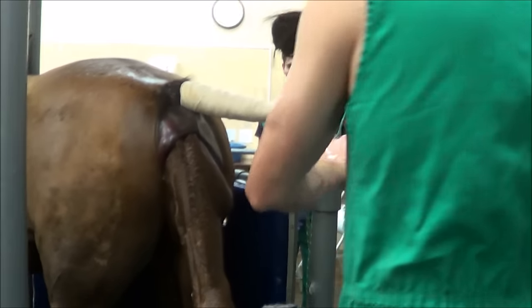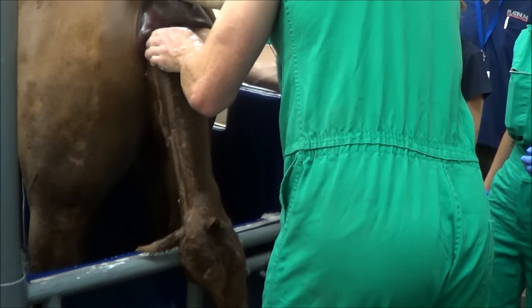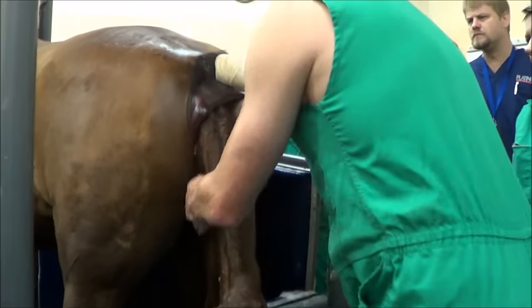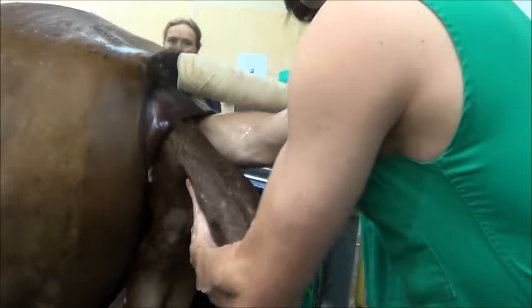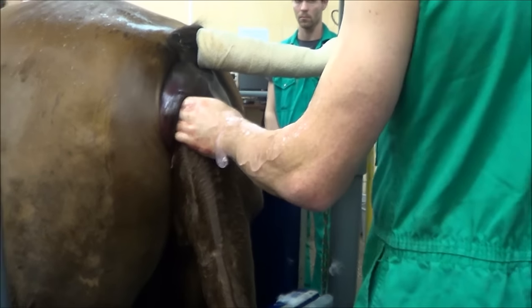Here you can see a very nervous mare restrained in a crush. The problem is fairly obvious. I've thoroughly scrubbed my hands and forearms up to the shoulders. A tail bandage has been applied to the mare and her perineum has been meticulously cleaned using soap and water. I put a lot of freshly prepared methyl cellulose and chlorhexidine lubricant on my hands and arms as I commenced my vaginal exam.